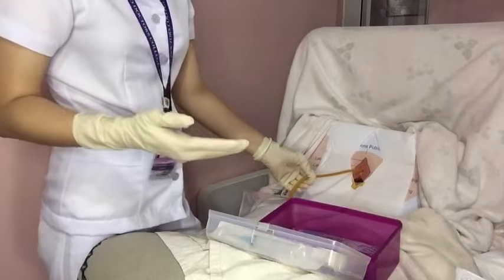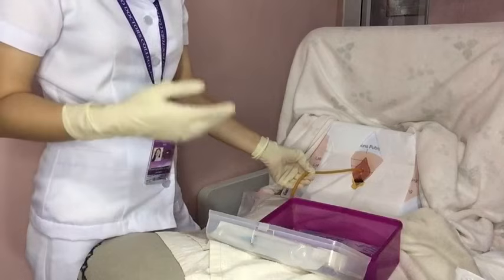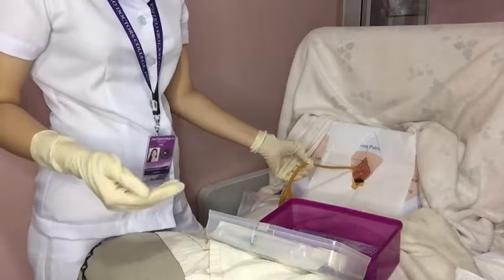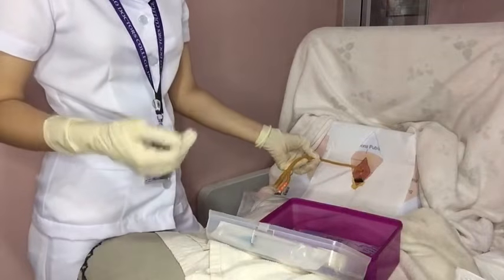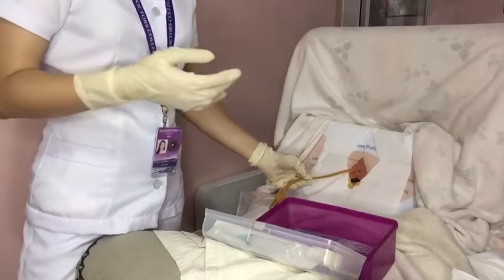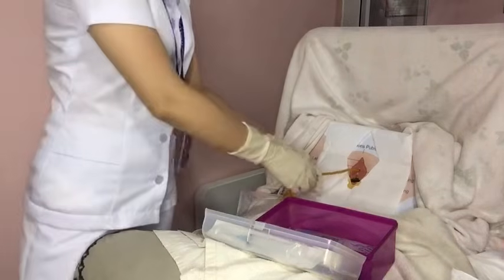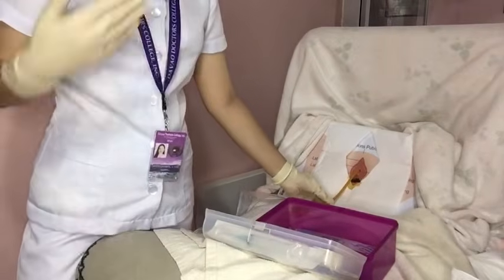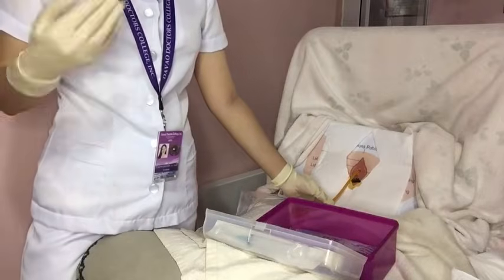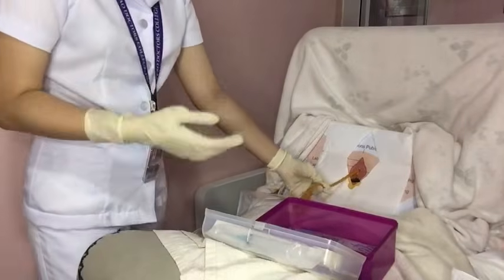Now, if a specimen is to be collected, pinch the catheter with the thumb and finger while placing the specimen container in position, because urine will flow out of the catheter if the lumen is not occluded. Now rest the hand on the pubis area while holding the catheter in place to prevent pulling and pushing of the catheter. Withdrawing the catheter and pushing it back into the urethra increases the possibility of contamination of the urethra. Then afterwards, connect the catheter to the urine bag.